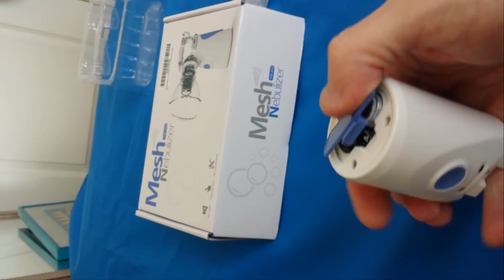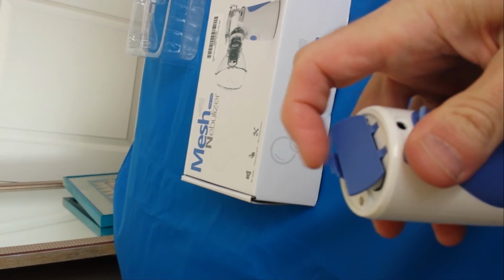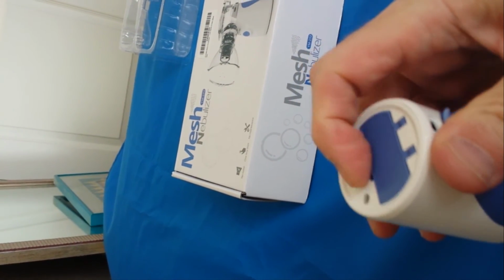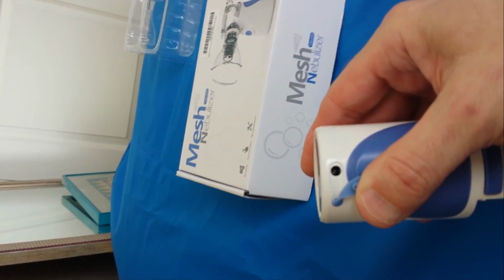Then you close this down, gently putting it down so you don't break that. You also can run it off the USB.